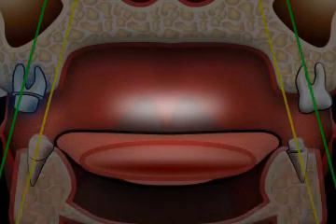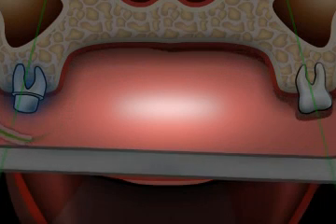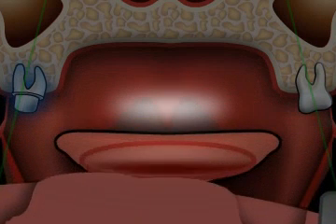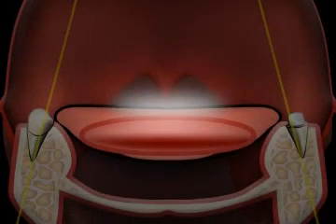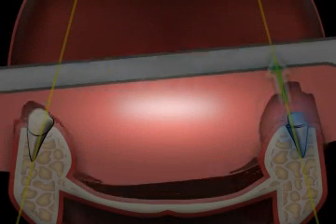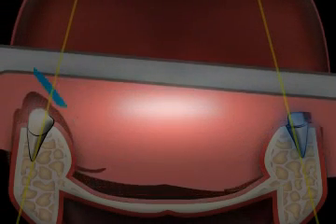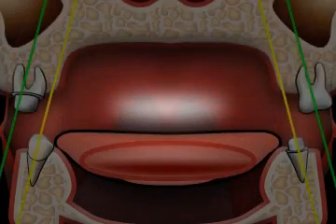For example, because of the occlusion of the teeth, the impression in the upper jaw should be taken on the opposite side of the cut teeth first, shown here in blue, because this way the impression is pulled off in a lengthwise direction from the cut tooth, and therefore is less likely to become deformed. The teeth in the lower jaw are leaning towards the inside. Therefore, the impressions in the lower jaw should be prepared and pulled off on the side of the cut teeth first. If the impression tray is removed on the wrong side, the impression material is then more likely to become deformed. Taking such details into consideration prevents the impression from becoming deformed.